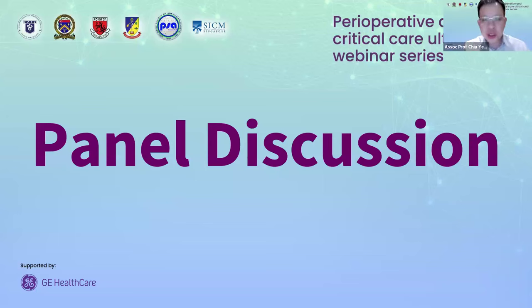So I'm a cardiologist and intensivist, and I think that the use of POCUS has been rising, not just in the cardiac ICU, but in all the ICUs in my hospital. It does help us make decisions in terms of identifying the reasons for shock, for example hypovolemic, cardiogenic, obstructive, because the patients could all well have the same mean arterial pressure. So a very simple focused assessment allows us to make good decisions, and to use ultrasound to guide our choice of preload responsiveness assessment before fluid administration.